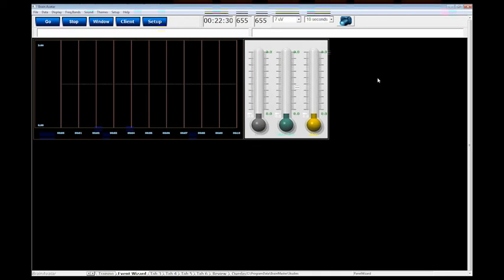Oh, okay. My patients really prefer it to the second monitor. It feels like a cocoon kind of feeling. It seems to pick up the audio really well. Not surprisingly, Sony is very good with audio. And the video is remarkable. It is very, very precise. People just talk about a cocoon kind of feeling with it.